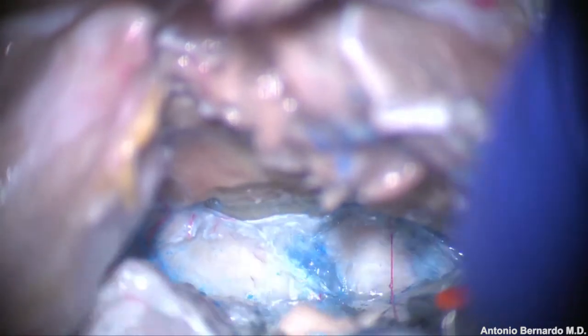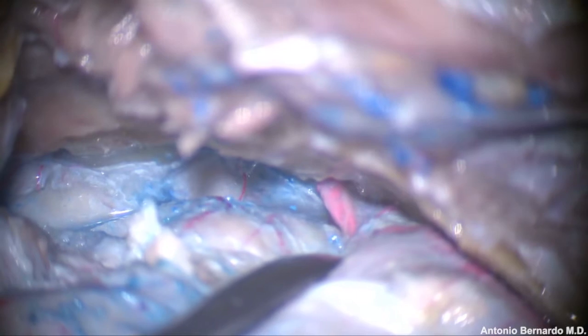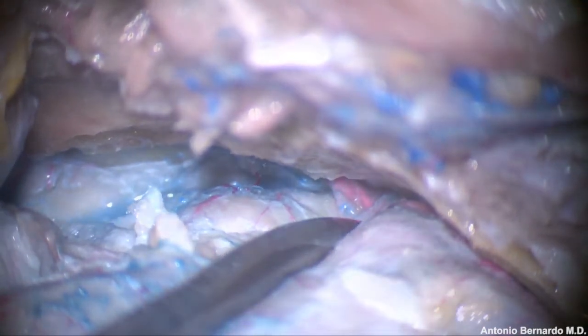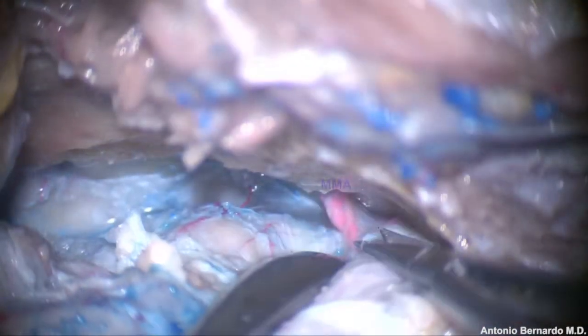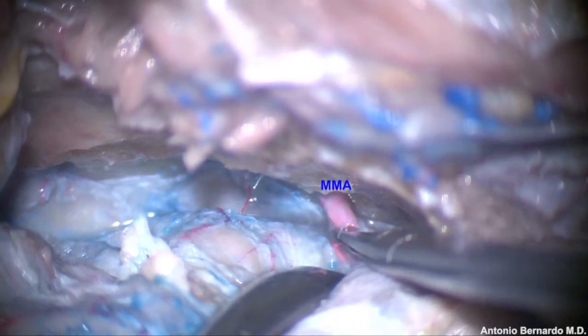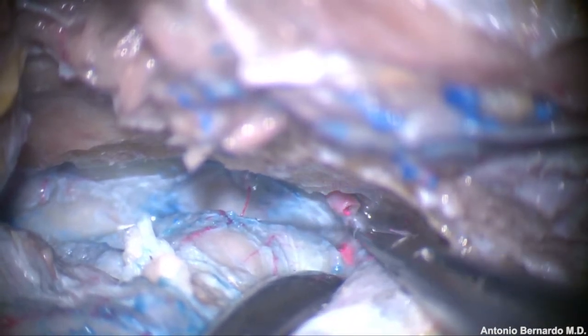The periosteal layer has been left on the floor of the middle fossa, and the two layers are separating from each other. This maneuver allows further elevation of the temporal lobe. The middle meningeal artery is exposed and needs to be cut in order to allow further elevation of the temporal lobe.